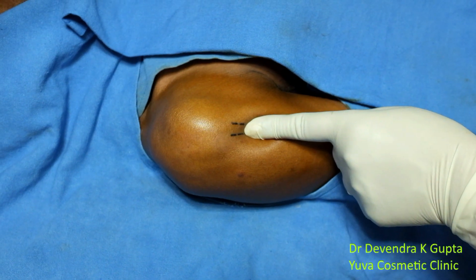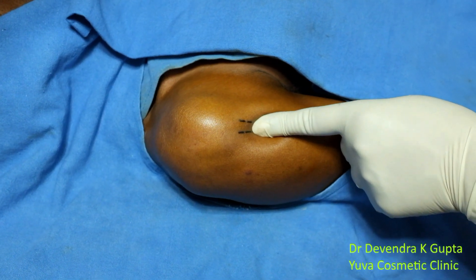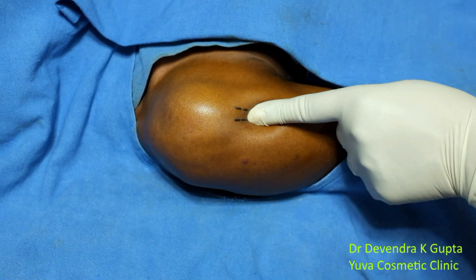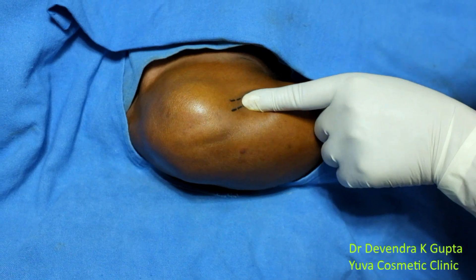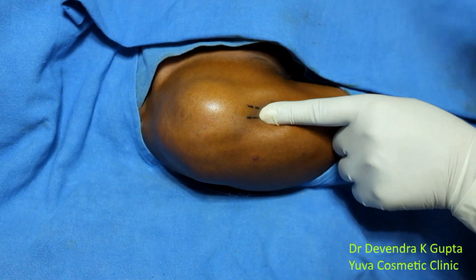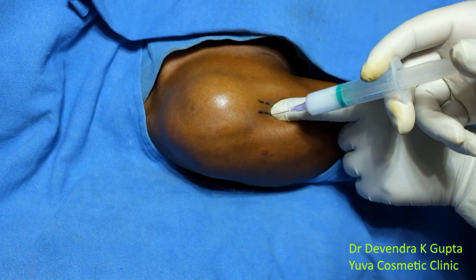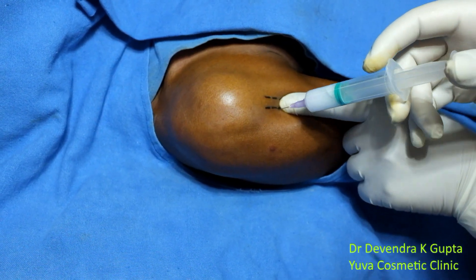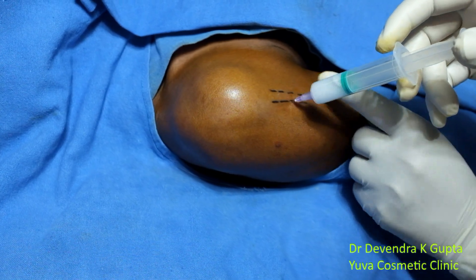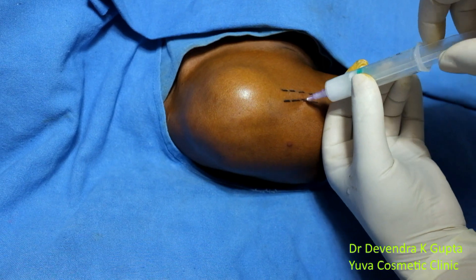Using a 24-gauge needle, I am injecting around 30 mg of depomedrol by the side of this tendon. There should not be any resistance here. Now it has reached the bone — just release the finger, keep things in place, and there should not be any resistance.